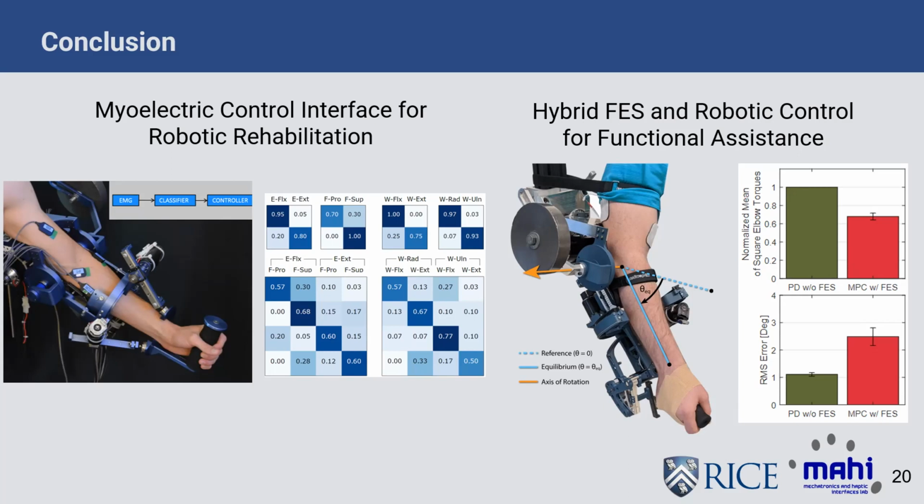So there's not too much difference on that level. In terms of familiarity with EMG, I think we certainly do see some different results if subjects understand what they're doing more because they know how the systems work. So I think there could be a level of explanation of how these technologies work, and that could help influence and get some better results. Cool, thanks.